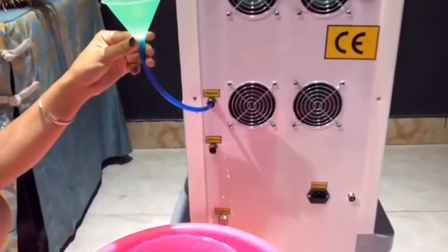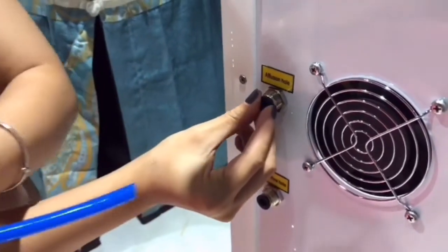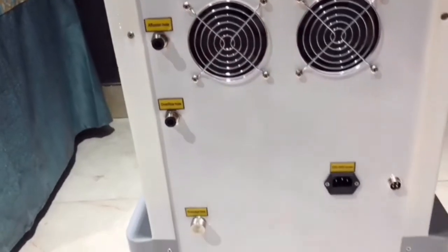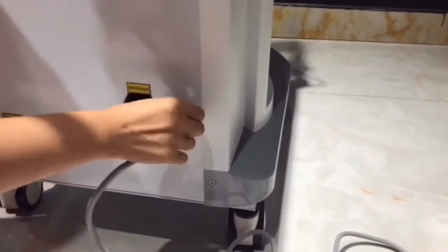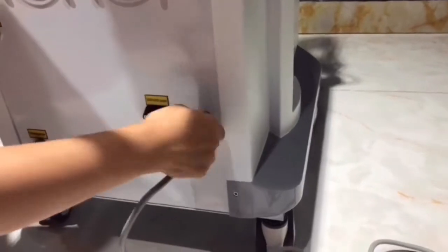Every month, replace the water. After filling, take off the pipe. No need to cover the water inlet and overflow holes for better water circulation — just cover the drainage hole. Connect the foot pedal.